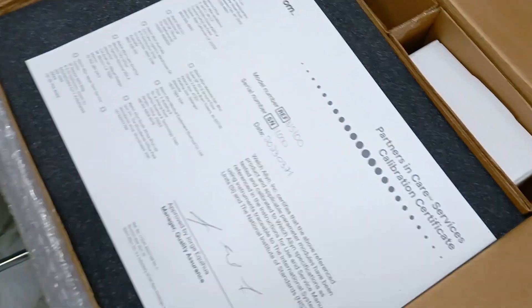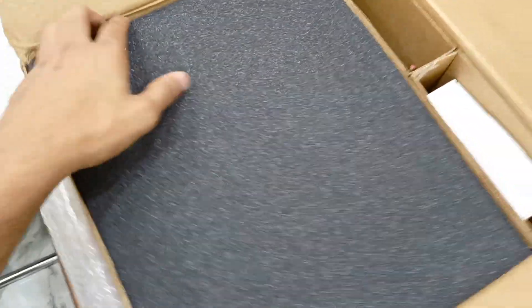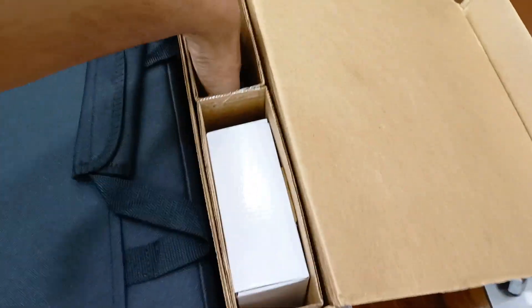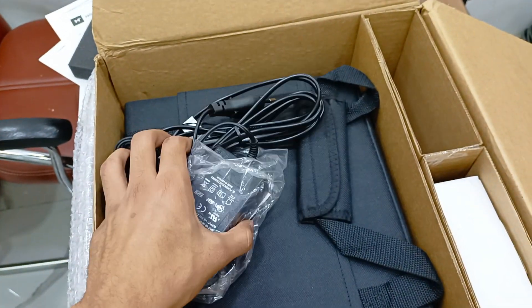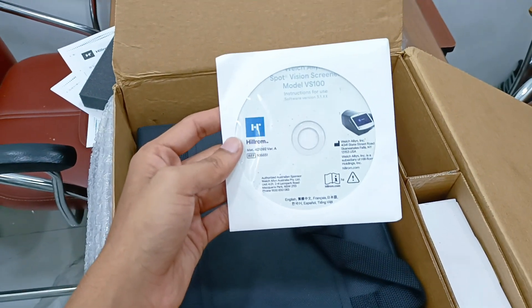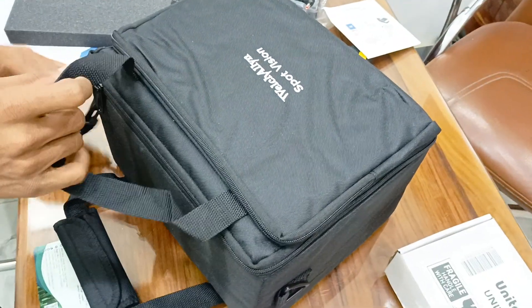Discover what's in the box: a bag, charger, and instruction CD.